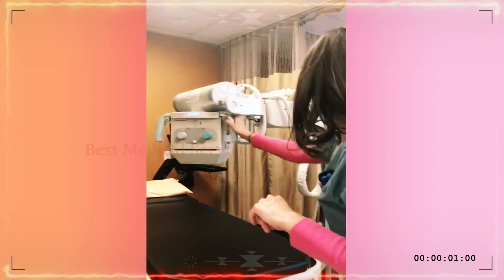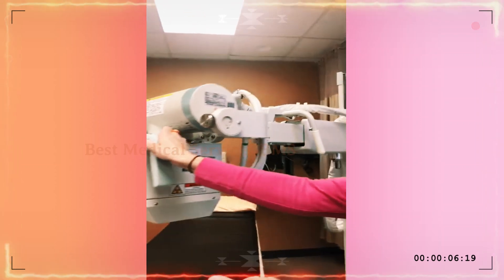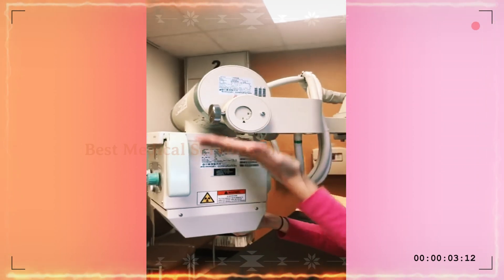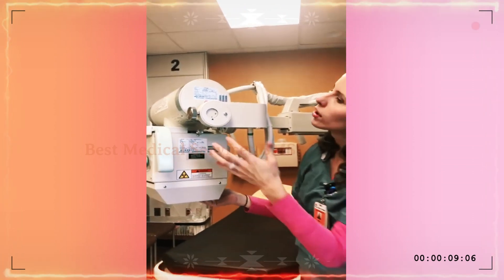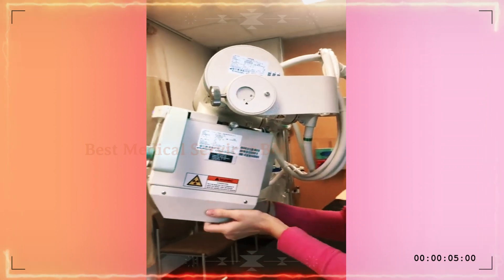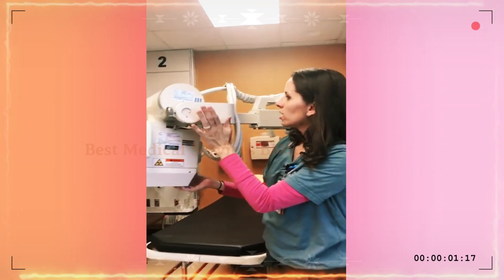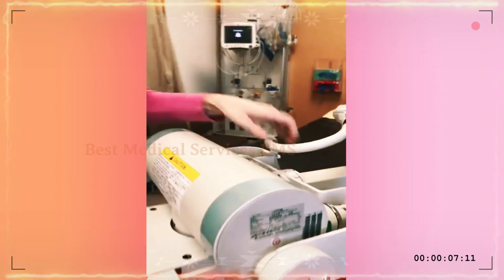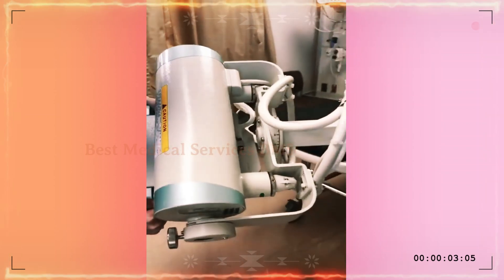Now we're going to talk about the angulation. There are two different angulation sets and meters that you'll find on your portable. Right here is one, and it's very helpful to know that you're at a perpendicular beam to a table, desk, or whatever you might be taking your X-rays on. If you need any sort of angle, you can just push the collimator's leaves and you'll see your angle changing. There's also another set of angulation meters here — this is the whole tube angulation itself.